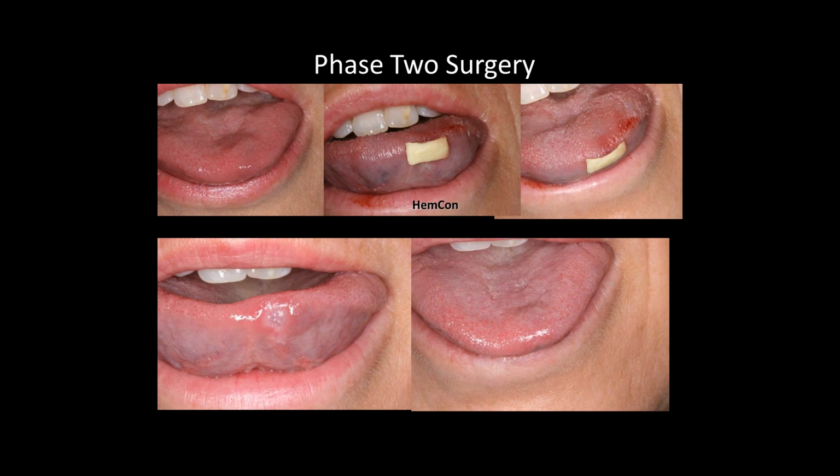So on gingival tissue, are you just ablating with the erbium YAG? Yep, just take the erbium YAG. The tipless works great. Just ablate the pigmentation down all the way through the gingival epithelial tissue, and then let it grow back in by secondary intention, and that pigmentation won't be there when it grows back in. So you eliminate it. It's all in the gingival layer.